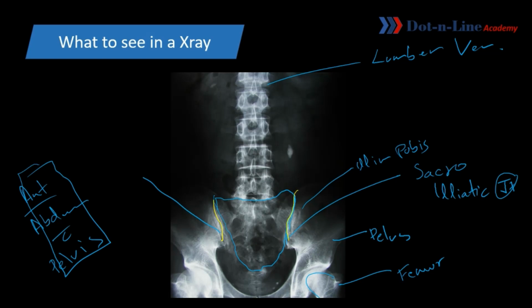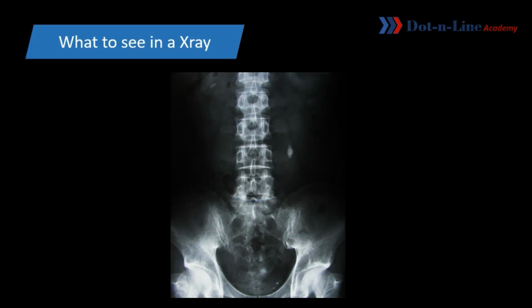So what is the defect here? What is the disease here? This. Renal calculi. Yes, we can find the renal calculi, the distinct renal calculi from the X-rays. So there are many possibilities. There are many defects that we can find from the X-ray. The more you practice, the more you learn. So here the topic ends.